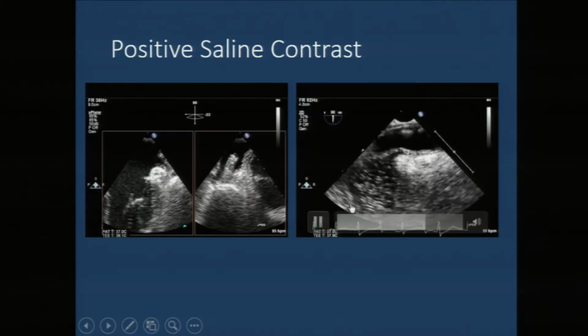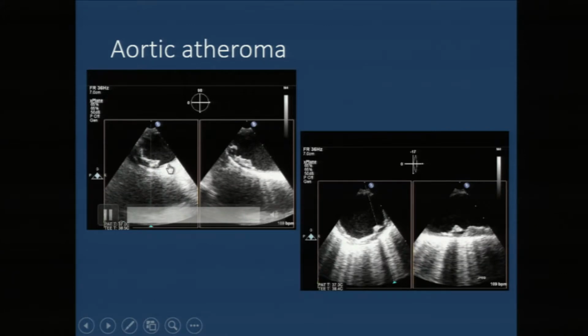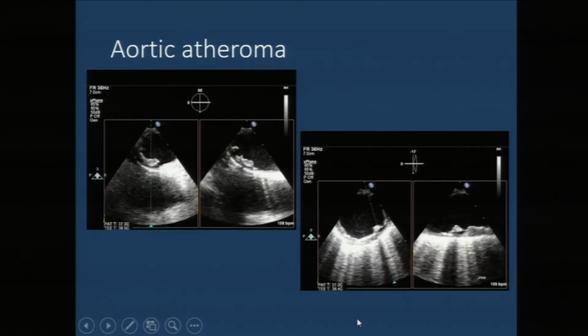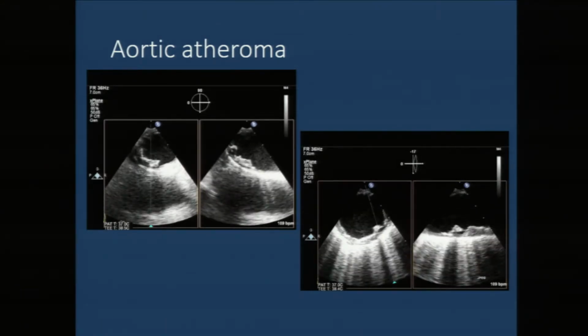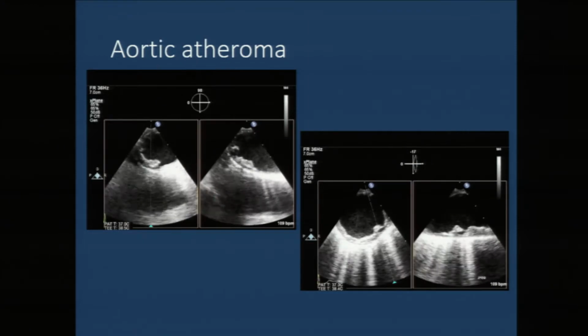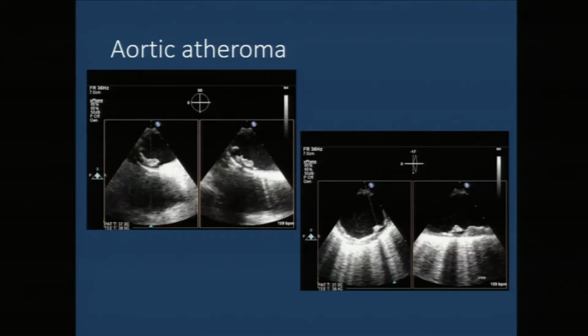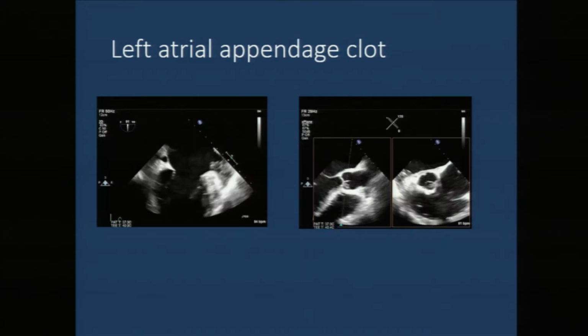And then in the same patient, when we were looking at the aorta, the descending thoracic aorta and the arch, you can see significant atherosclerotic plaque, even mobile debris. This is at the level of the arch. And so you have to make a clinical diagnosis here, whether it was the small PFO. This was an elderly, 84-year-old patient. Most likely it's the atheroma that's causing it and not the PFO, which probably he has had since birth. So again, significance of this.